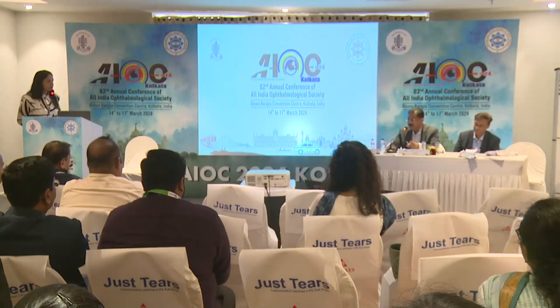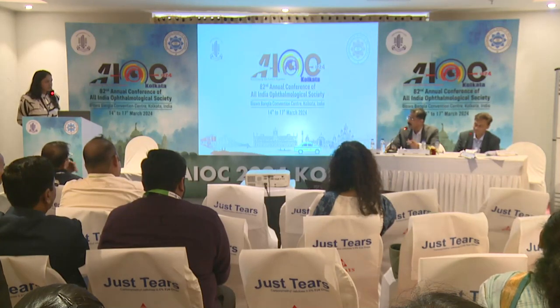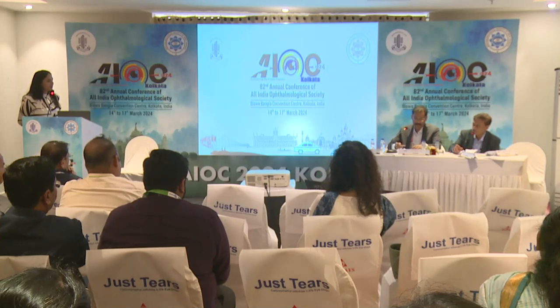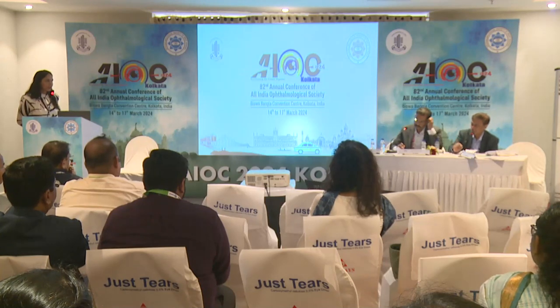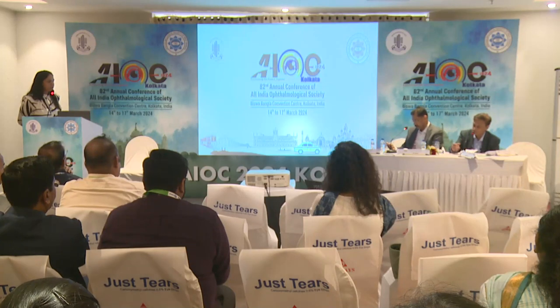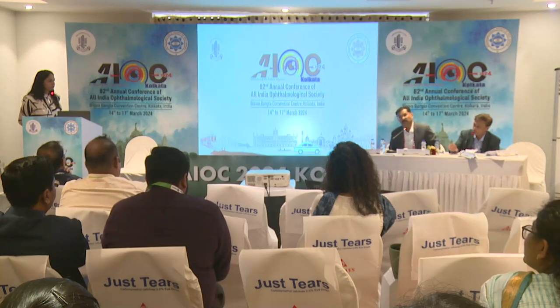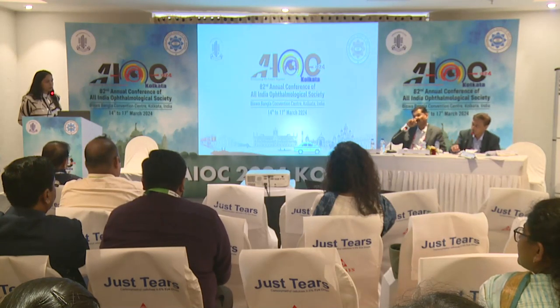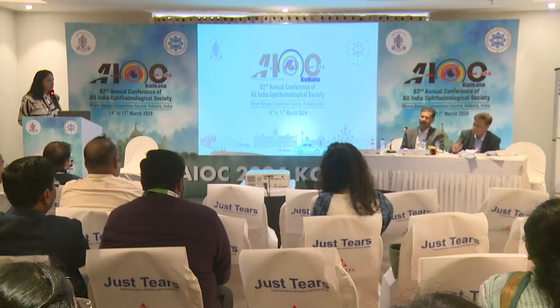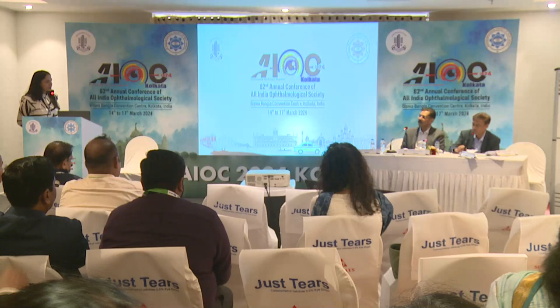And the decision to take this kind of soft cataract, to think that it is easy to do for a novice surgeon, is also wrong. Absolutely. Actually, with Ozil technology phaco, it is difficult to operate softer cataracts. Absolutely. And the tip was a new tip. For that, you just reduce the power. There should not be any oscillations. You can keep it on very minimal, only 20% oscillation. And vacuum. So you can just remove it by vacuum. Because the moment you go to position 3, you start eating the lens and then it's very difficult. Okay. Thank you, sir. Thank you.